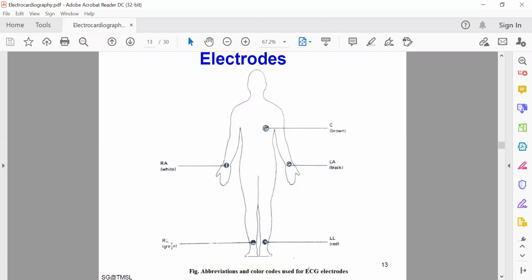For this reason, in a normal electrocardiographic examination, the electrocardiogram is recorded from a number of different leads. Usually 12 leads are used to ensure that no important detail of the waveform is missed. The placement of the electrodes and the names and configurations of the leads have become standardized.